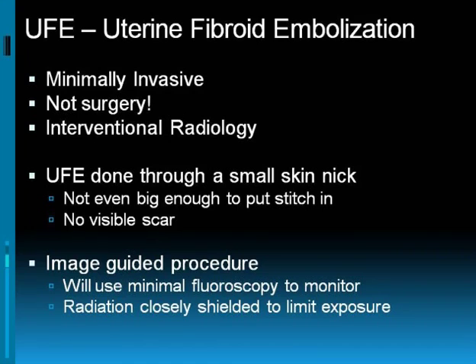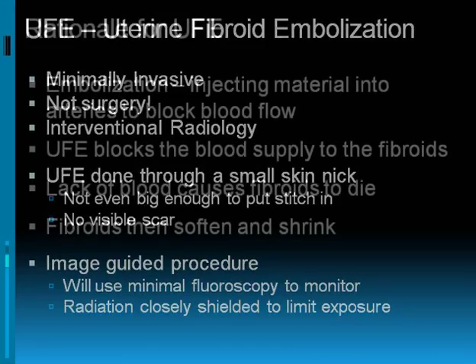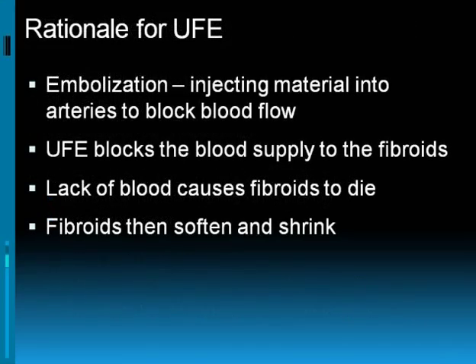As I mentioned, this is an image-guided procedure, so we do use a small amount of fluoroscopy to monitor what we are doing, although the radiation associated with this is very minimal since we closely shield the patient during the procedure. Now, the rationale for UFE is shown here.